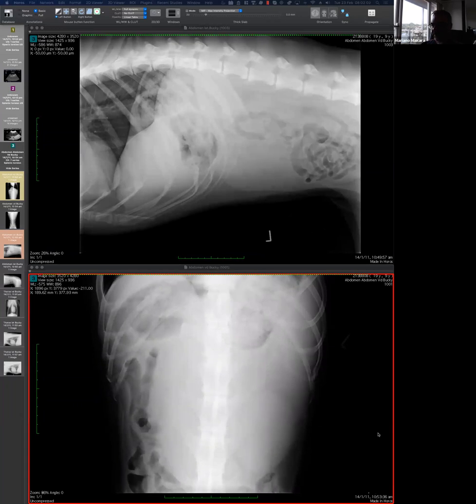They are not technically the best. And then the history, let me just bring the history. And also share the link to the images so you can open them and take a look.